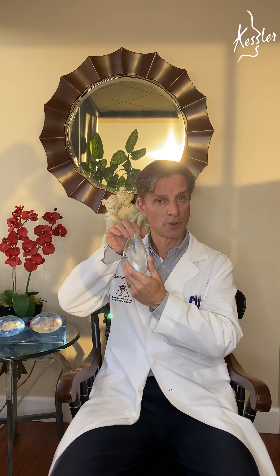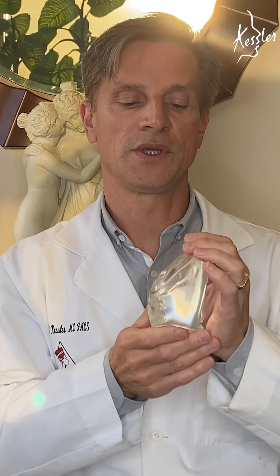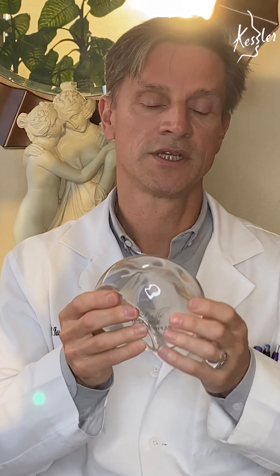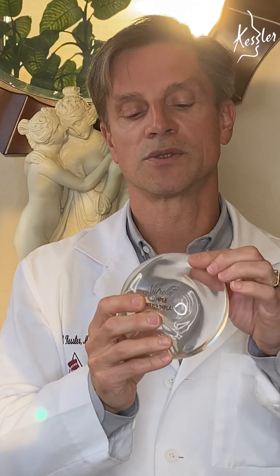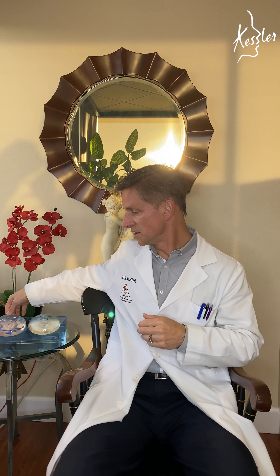These implants come in three degrees of cohesiveness. The softest are called responsive gel — when you hold them up you see rippling and they lose about 16 percent of the volume in the upper pole when standing. The soft touch is intermediate in cohesiveness, loses about nine percent, ripples less, but is still soft. The most cohesive gel implant is the firmest, ripples the absolute least, and only loses about three percent of upper pole fullness, but the trade-off is it's a little too firm in my opinion. How we choose which implant for which individual is based on how important upper pole fullness is, how thick the breast tissue is, and whether it will camouflage rippling. Usually I'm in the soft touch camp, which is kind of the best of both worlds — it's soft and less likely to ripple.